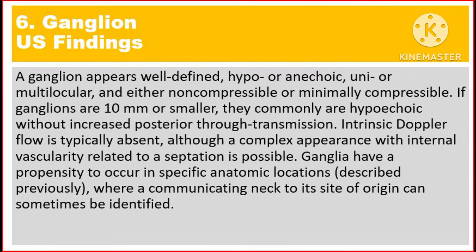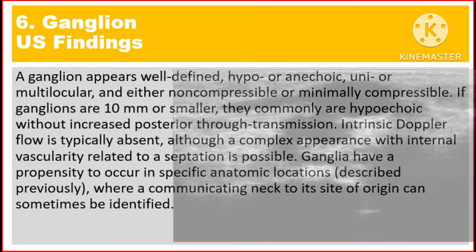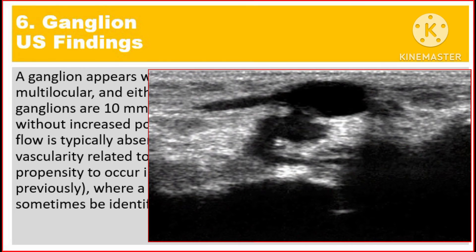Ultrasound findings: A ganglion appears well-defined, hypo- or anechoic, uni- or multilocular, and either non-compressible or minimally compressible.